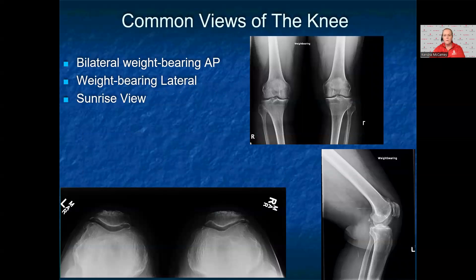In sports medicine, when examining the knee, it's important to have weight-bearing views. This will best show the knees in their natural anatomic positions to assess for alignment as well as joint space narrowing. There may be some instances where the patient can't bear weight, but when they're able to, you want to specify that you want the x-rays weight-bearing. The common views done of the knee are bilateral weight-bearing AP, weight-bearing lateral, and the sunrise view.